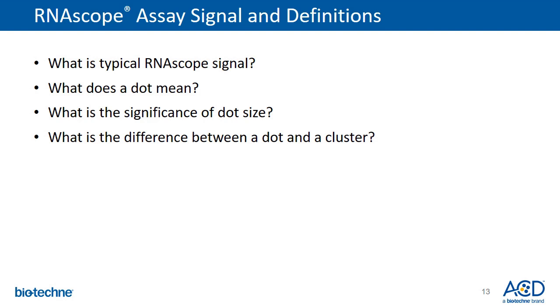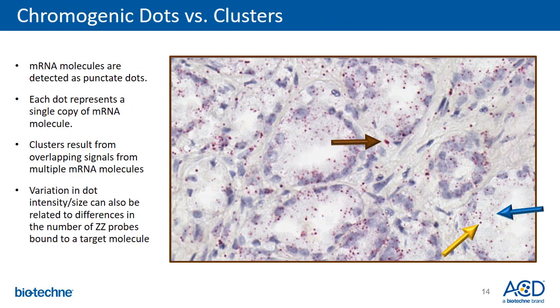Oftentimes we have customers asking questions such as: what is typical RNAscope signal, what does a dot mean, does the dot size really matter, and why do I sometimes see a cluster versus a dot? In this image, where RNAscope chromogenic red assay was performed, signal appears as numerous punctate red dots of different sizes and intensities and a few clusters. It is the number of dots and clusters that are important for signal quantification, rather than the size or intensity of the dot. Each punctate dot equals one mRNA molecule — either a small dot or a larger round dot represents one mRNA molecule.